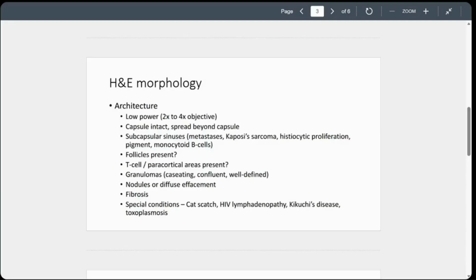If they're nodules, you may be thinking about nodular lymphocyte predominant Hodgkin's, nodular sclerosing Hodgkin's. If it's got a vague nodularity and some follicles as well, you might be thinking about a marginal zone lymphoma, because that can give a vague nodularity. You can also get a vague nodularity due to the presence of proliferation centers in small lymphocytic lymphoma slash chronic lymphocytic leukemia. But if they're proper follicles, then you have to work out whether the follicles are either reactive or neoplastic. If they're neoplastic, it's follicular lymphoma. And if they're reactive, it could be one of many reactive conditions.